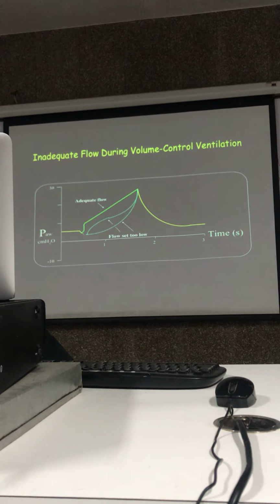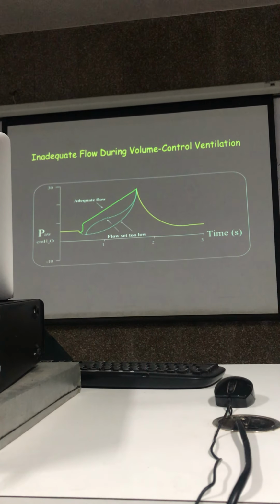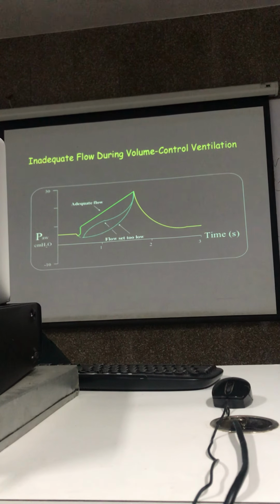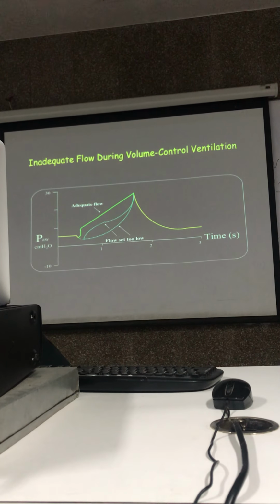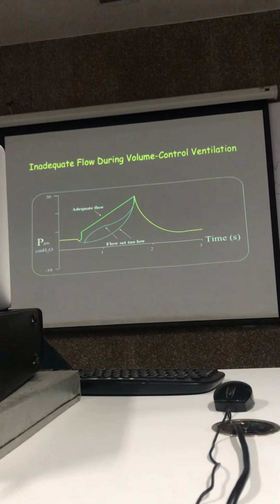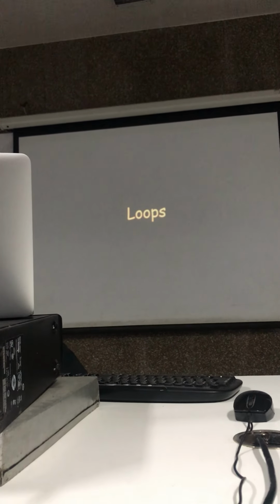So you adjust your ventilator to increase the flow. Okay? Try this on the Puritan Bennett ventilator. You will look at the waveform and you will recognize that when you reduce the flow, you will see this happen again. So it's the best way to look at it.